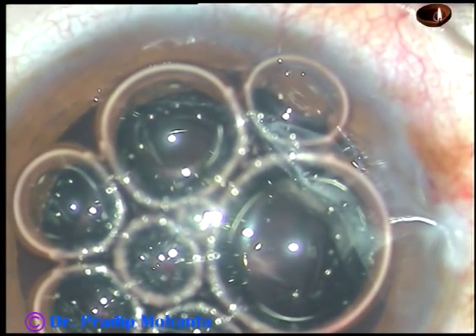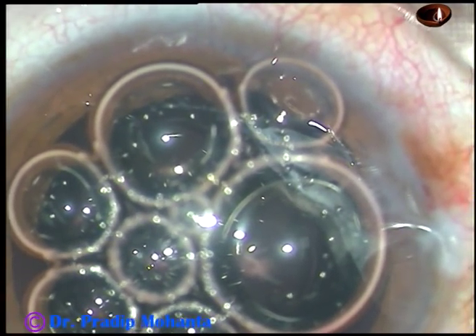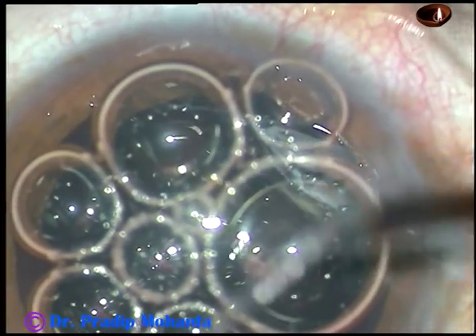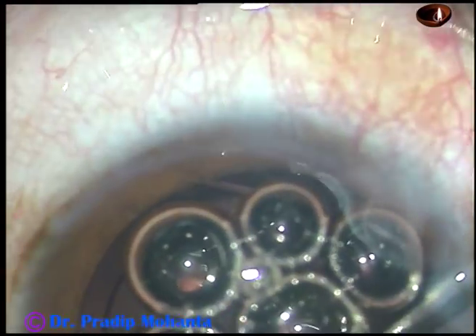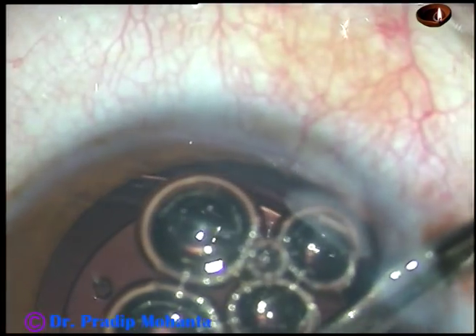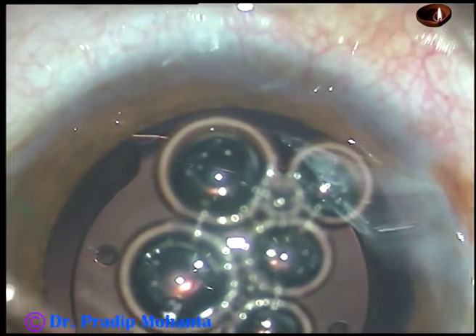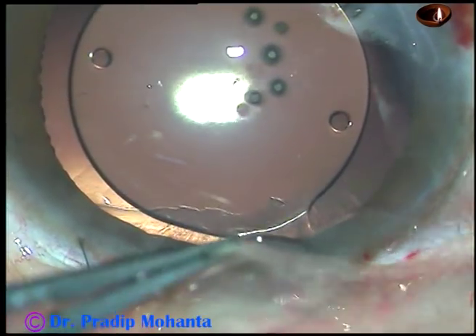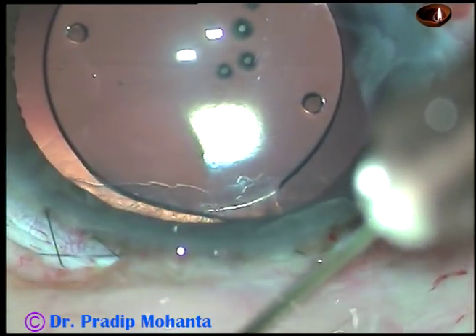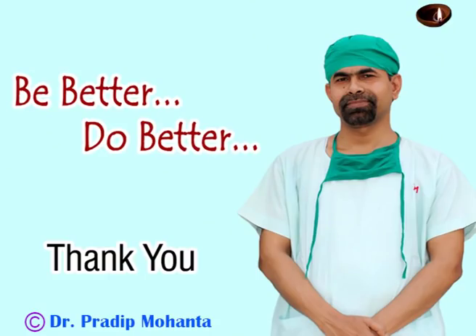Now remove the air and make a final lavage of the anterior chamber using a 23-gauge Simcoe cannula. Remove the air bubbles — even if you don't remove all the air bubbles, it doesn't matter. Check the integrity of the wound and inject some gentamicin and dexamethasone a little behind — this will cause apposition of the conjunctiva to the limbus. Thank you very much for watching. Hope this video will help you in learning ECCE.